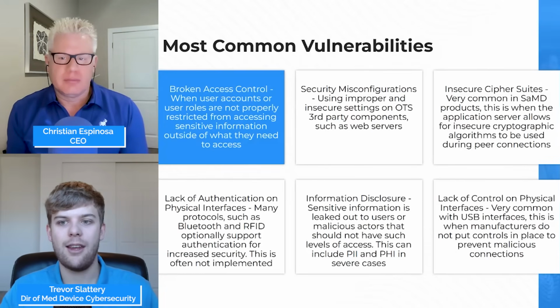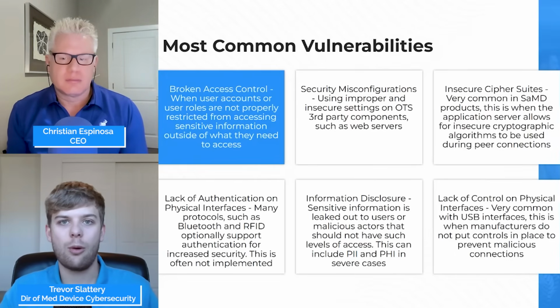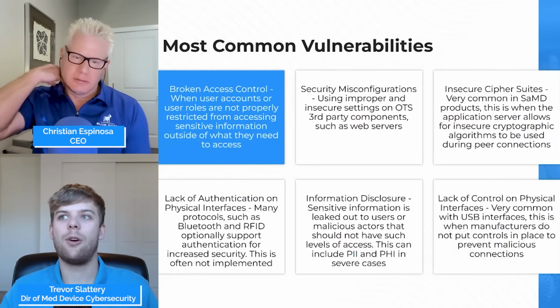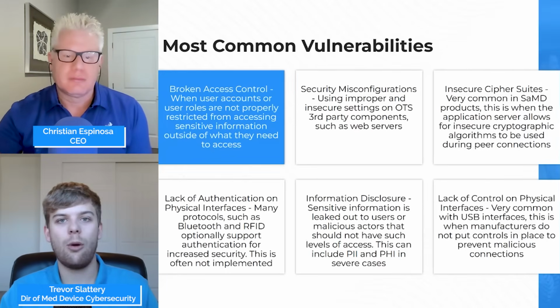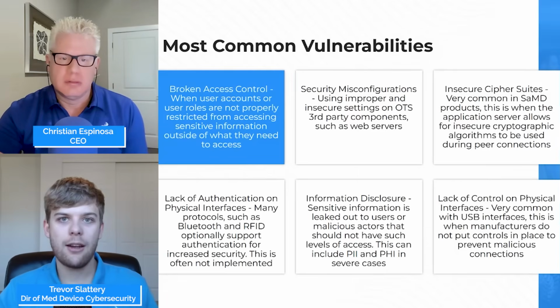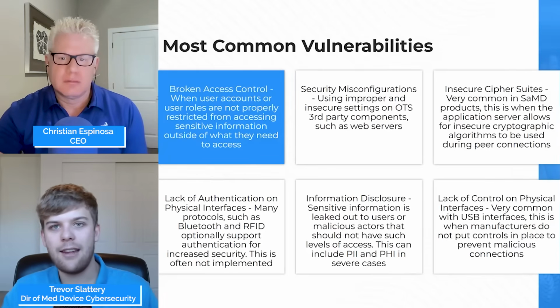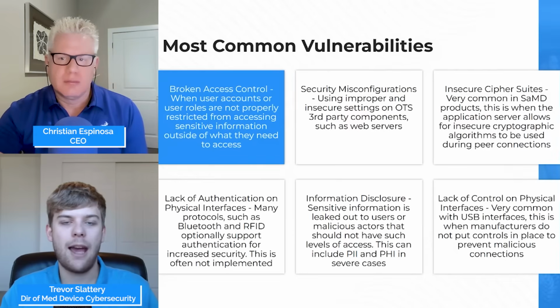A common problem that we'll see is on a device, there will be a USB port that's intended for like an update, or it's intended for just data transfer, but it allows for executable devices to be put in, or removable media, or a mouse, or a keyboard, or a hot plug attack. There are a lot of different things that it allows when it should only allow for that data transfer or for that update package.